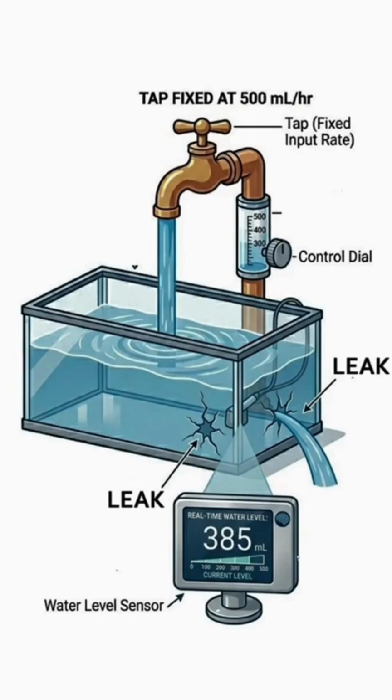To achieve the target of keeping the water at a particular level, what we can do is keep a monitor which tells us what the water level is at different points of time in the day. Now, when we have this information, it is easier to decide the rate at which we should leave the water tap open so that the level can be as much as we need throughout the day.